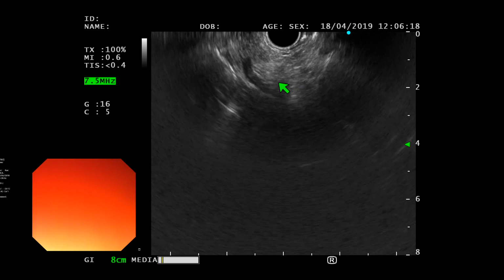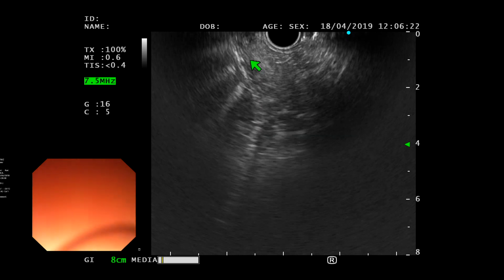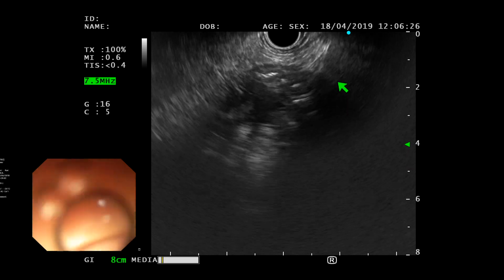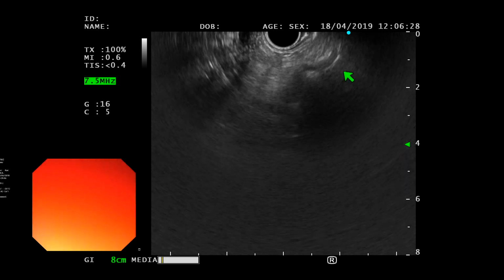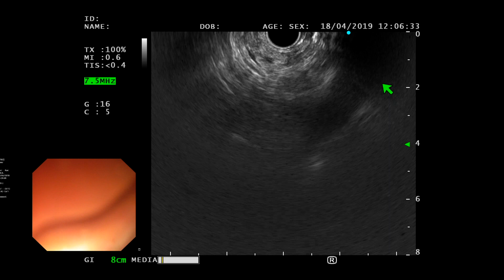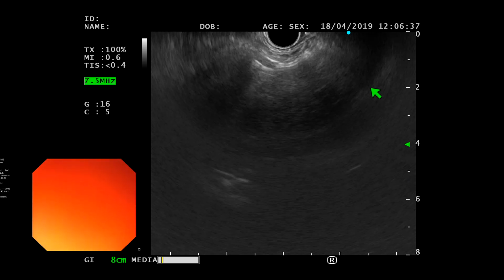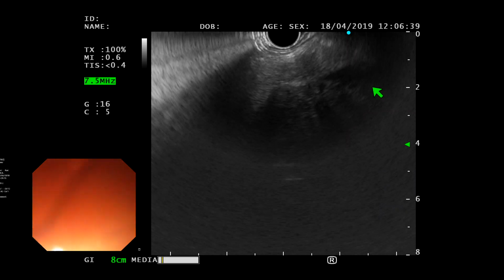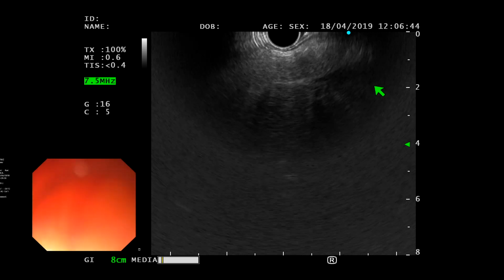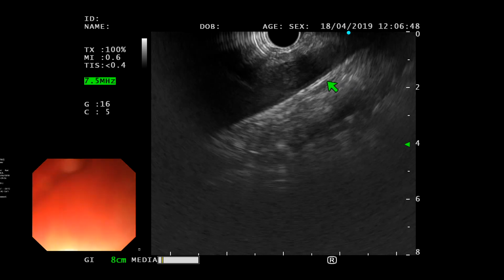No, sorry, the counter, the turn leftwards. Clockwise, flow position. Yeah, and so there's your, I think, pancreas. It's not the best view right now. So let's just find the celiac again, okay? So there. So liver, go clockwise from the liver. There you go. Now find your celiac again.